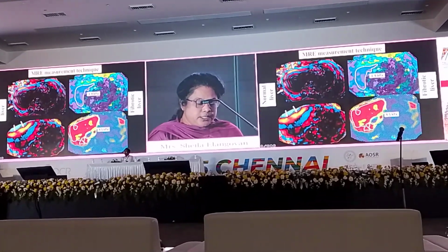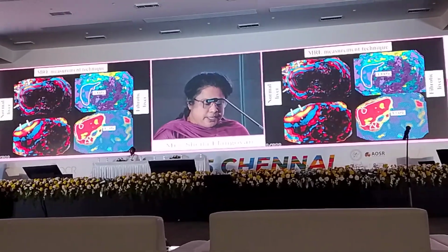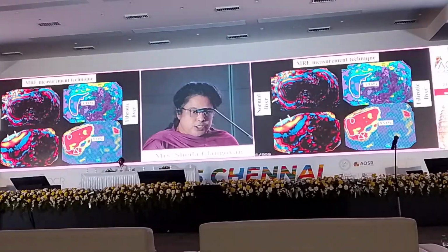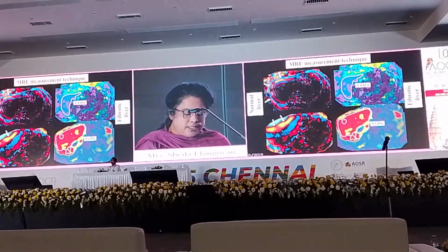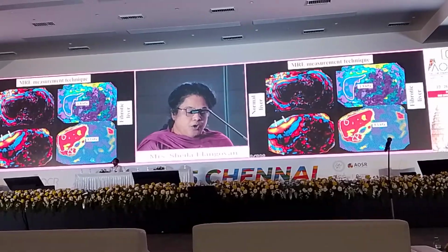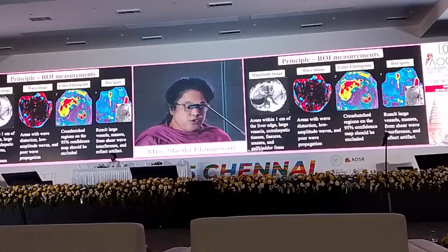Whereas here, it's in a patient with fibrosis and you can see that the wave is thickened, unattenuated waves, and you can see the wave is not distorted here, there are no dark signals here, and you can see that green through red is the color code in a color elastogram. So once you know that these images are correct, then you start your measurements.